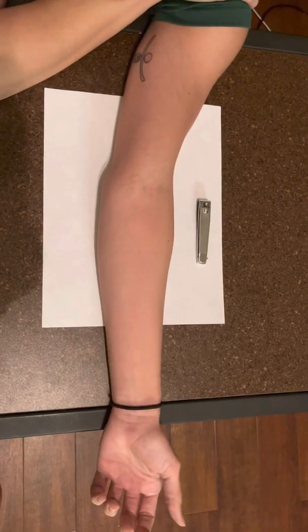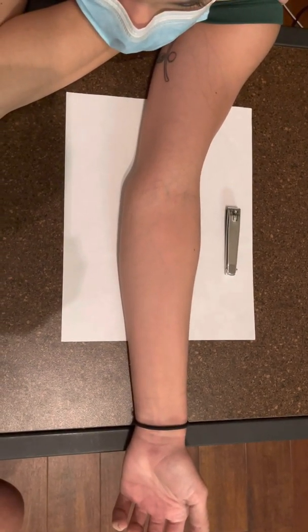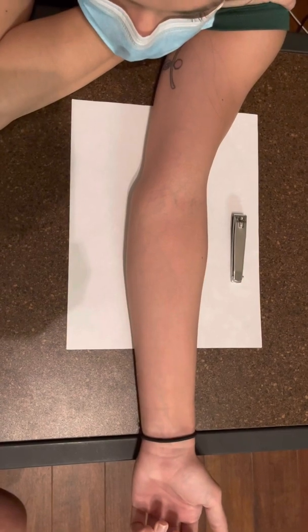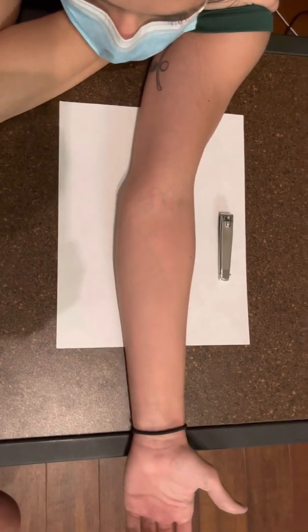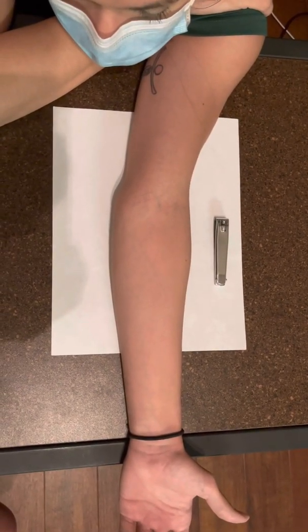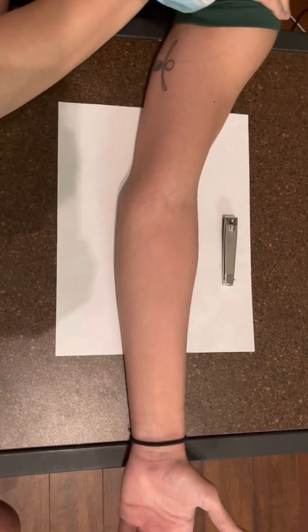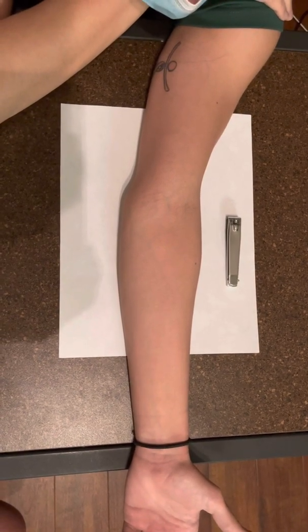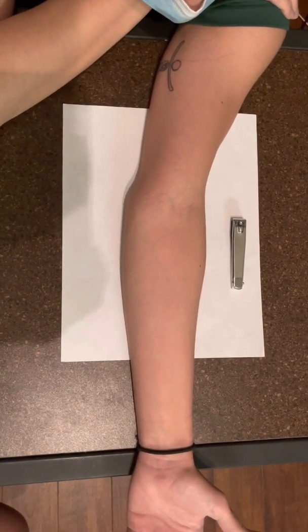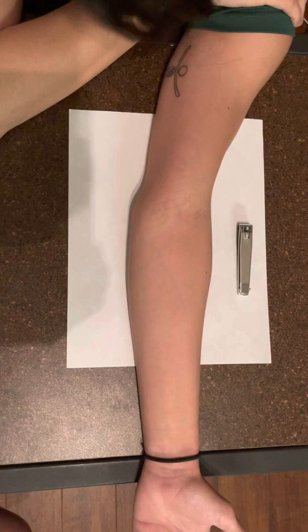The views for the elbow use a 10 by 12 cassette. For the AP elbow, the patient is supinated with the hand supinated and the elbow extended. The hand must be supinated to prevent rotation of the radius and ulna. Center the elbow joint to the center of the image receptor. A line through the humeral epicondyles is parallel to the plane. The central ray is directed perpendicular to the elbow joint. Anatomy demonstrated is an AP projection of the elbow joint, distal end of the humerus, and proximal end of the radius and ulna.